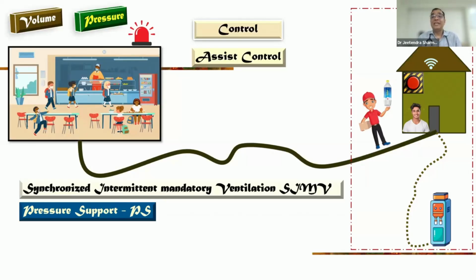This typically causes inadequate, ineffective triggering, or sometimes extra effort. Sometimes you think, but you just wait 2 minutes, 3 minutes, and then go. So this is also called delayed triggering. These are the pressure-based ineffective triggering and delayed triggering that can happen.